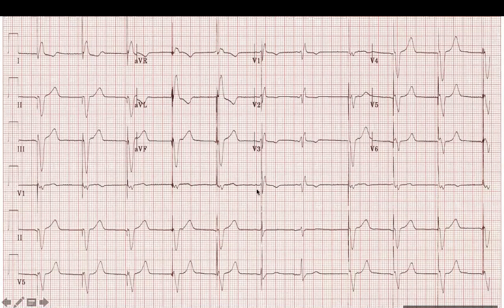So Abdullah? Yes, doctor, I'm with you. Okay, so we're talking about the sinus. There might be sinus bradycardia, some atrial activity here, so sinus node dysfunction. So the second is the pacemaker. We said there is pacing and there is good capture.